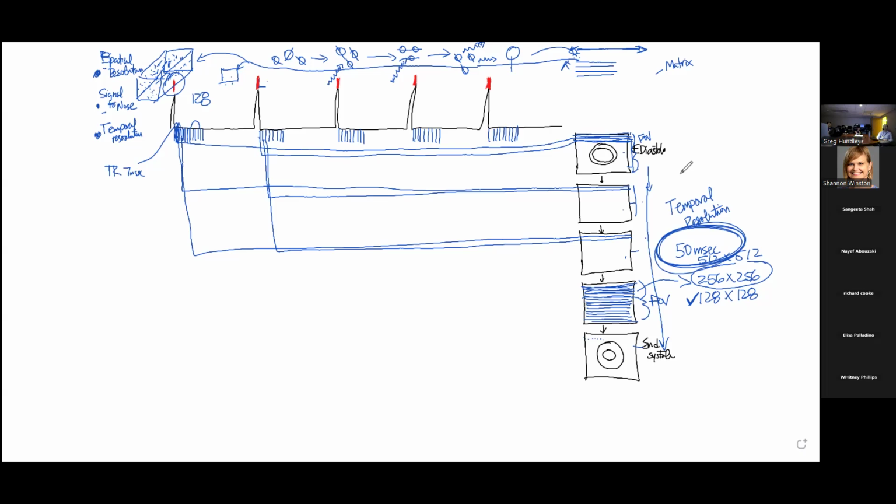But in cardiovascular medicine, and like in CT, we're trying to capture information for different reasons in different ways. But we give beta blockers and all that kind of stuff. And we do a lot of stuff to kind of get a heart rate in a range of 60 beats per minute. But in cardiovascular medicine, you're not going to have everybody show up very nice for you with a heart rate of 60 beats per minute. You're going to have people show up with 80 beats per minute, 120 beats per minute. And we still get those wonderful cine movies. So how does that work, right?